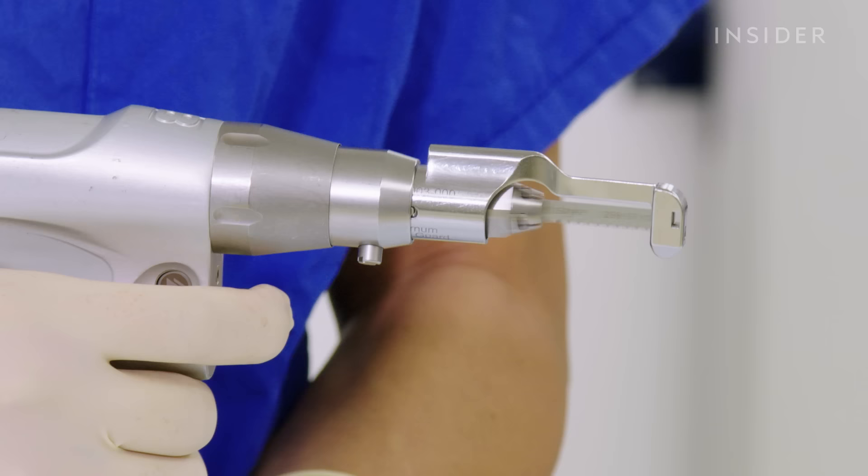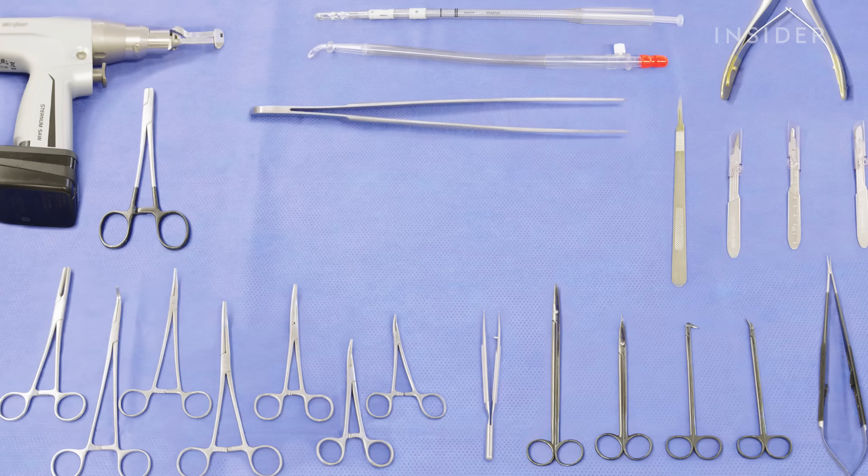Hi, I'm Dr. Leonard Lee. I'm a cardiac surgeon, and today I'll be showing you some of our commonly used instruments for heart surgery.